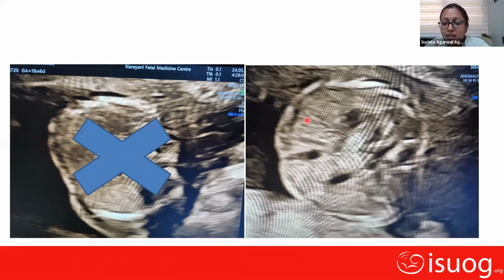So what about this? Here I'm getting a good stomach. Here a small umbilical vein is seen. But is this a single rib? No, this is multiple ribs. I get a single rib over here, but I don't get it here. So this is a wrong plane. This is not a correct AC plane.